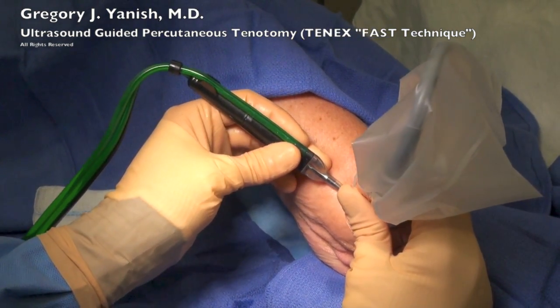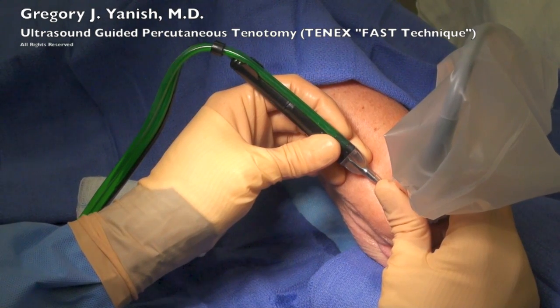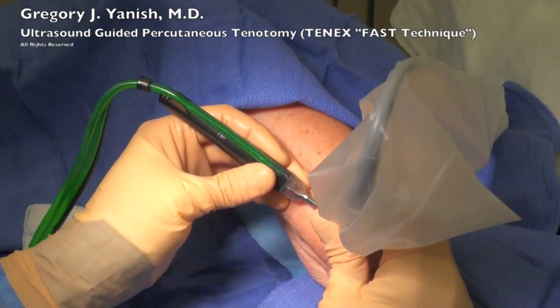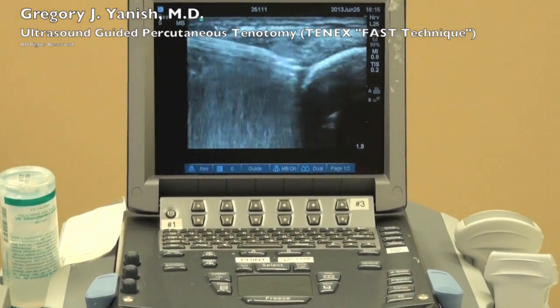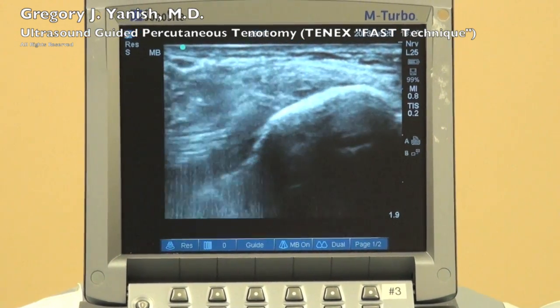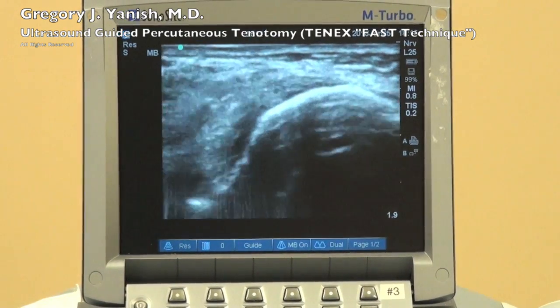I'm using ultrasound to position the tip of this instrument right into the area of injury. I also have a foot pedal below me that I'm using to activate the tip. This tip will use ultrasonic energy to cut, debride, and remove the dead portion of the tendon. You'll see that I'm moving this in and out and can follow it on the screen above under ultrasound. At the same time, I'm pressing the pedal on the floor and it makes somewhat of a hissing sound as it removes the black portion of the tendon that we saw earlier on ultrasound. You can see that it's removing it in real time.